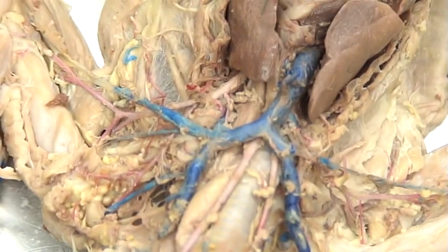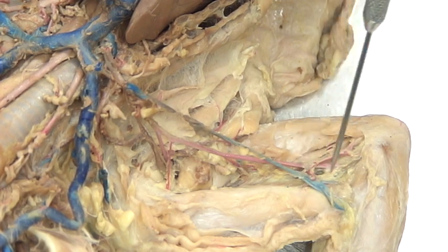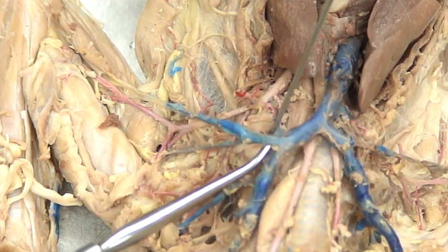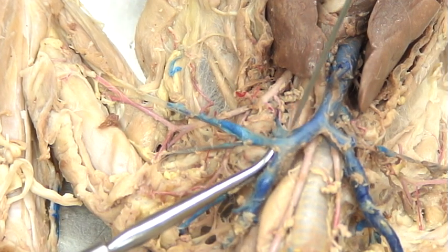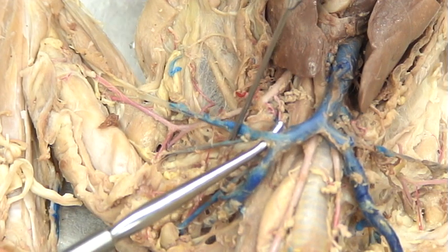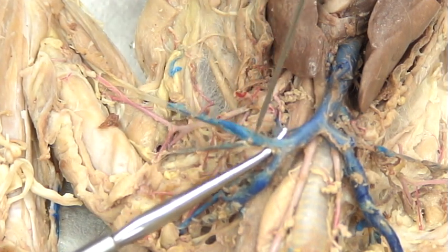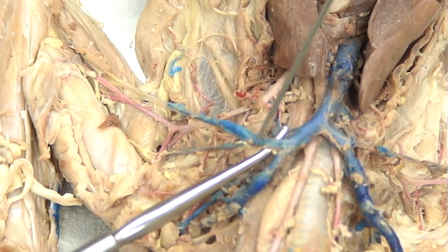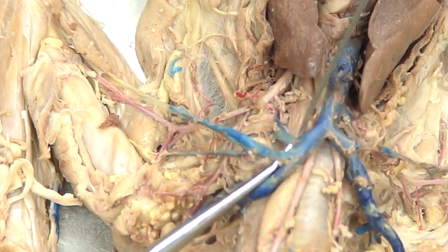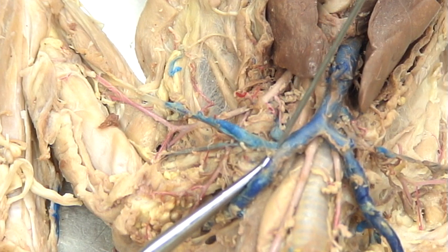Now if I work our way down to the arm, you'll see it will be on both sides. I'll be moving over to the right arm in a moment, but for now we're going to the left arm. The brachiocephalic is actually going to branch off, and then once we get past where the external jugular is, there's a small division. The branch that goes just beneath the clavicle itself is called the subclavian — it goes beneath the clavicle.